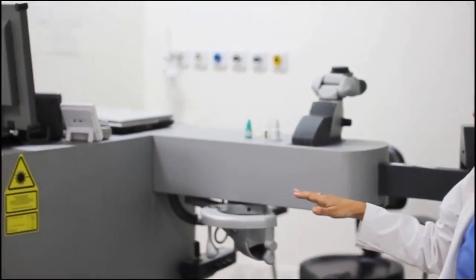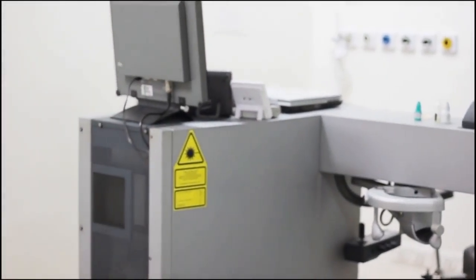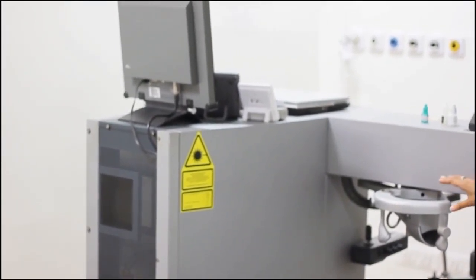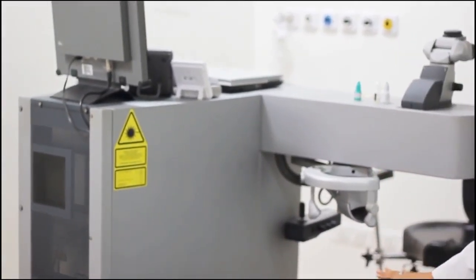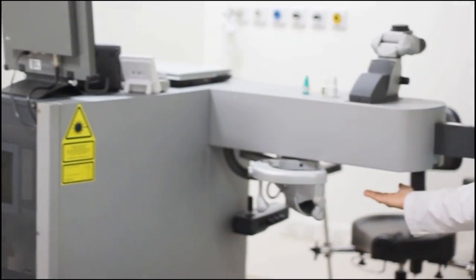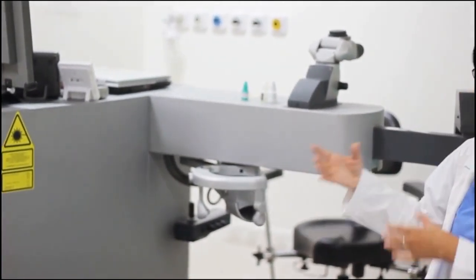This is the LASIK machine and from beginning to end it is a very comfortable procedure. The eye tracker is here, you position your head here, you come under the LASIK machine. In the beginning we put a ring to create a micro flap which raises the front portion of your cornea.